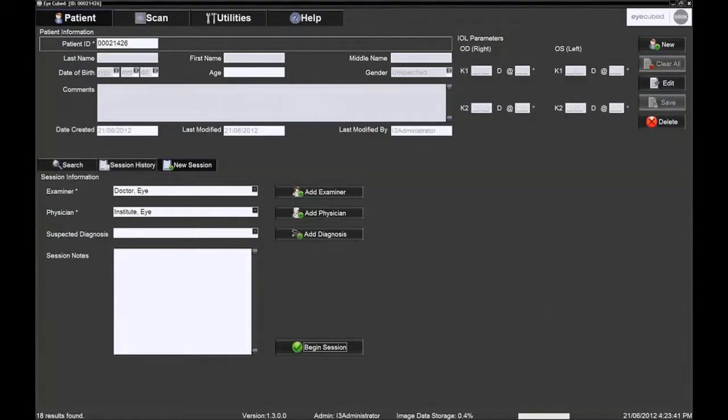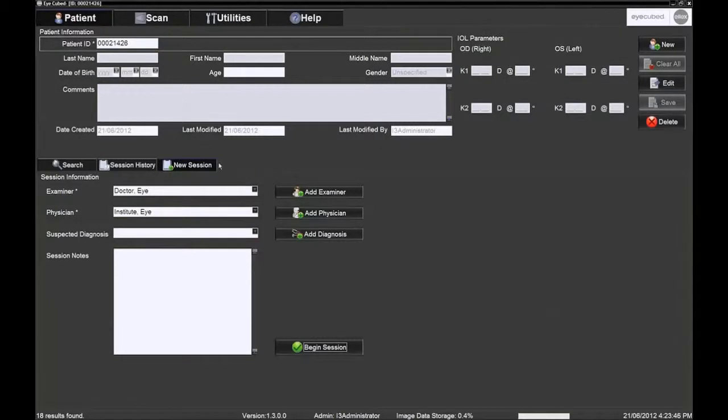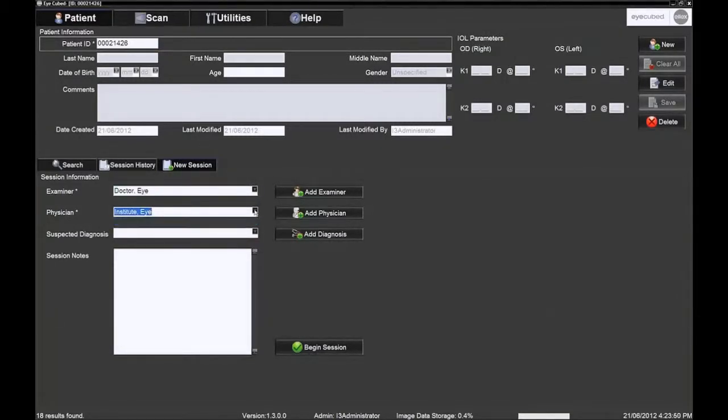To begin an examination session, you must select the examiner as well as the physician ordering the exam. At times, the examiner and physician will be the same. A default examiner and physician may also be selected.